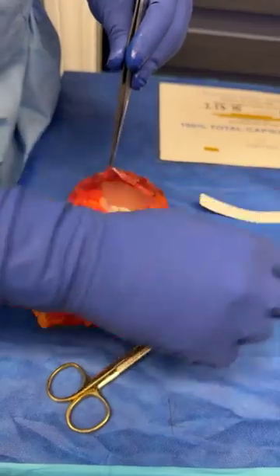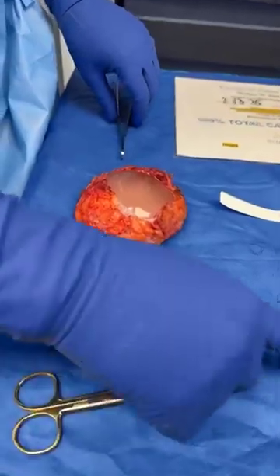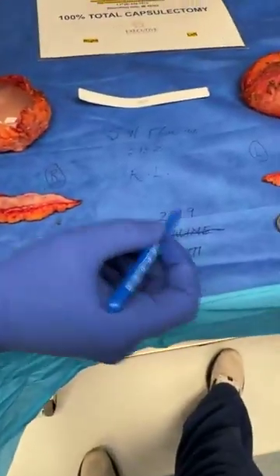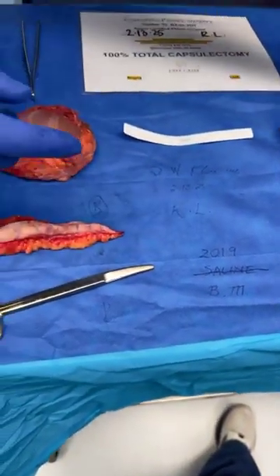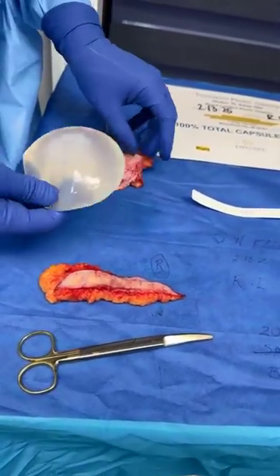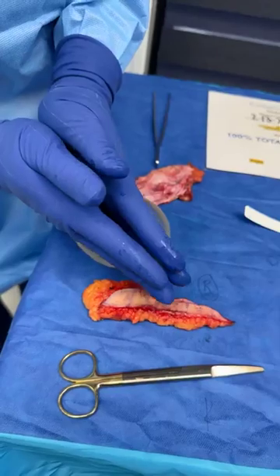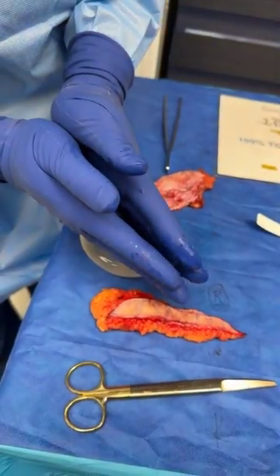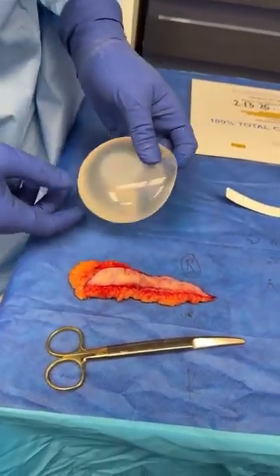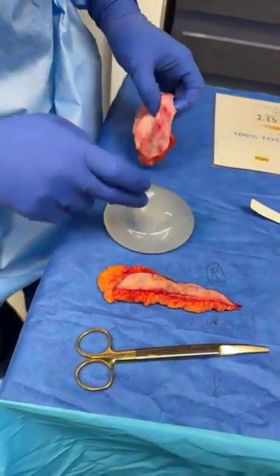And guess what? This is not your saline implant. It is actually your silicone implant. And I could tell by touching, examining her. And this is that small amount of, you can see, look at the gum sign, if you will, that leaching of the silicone. And this is your Allergan 220 silicone implant.